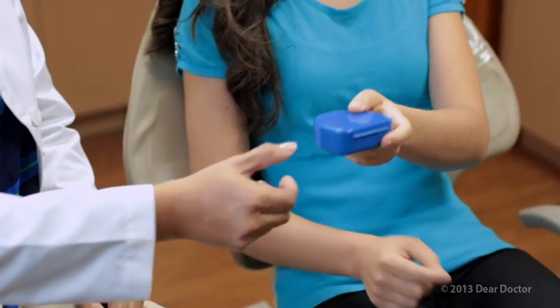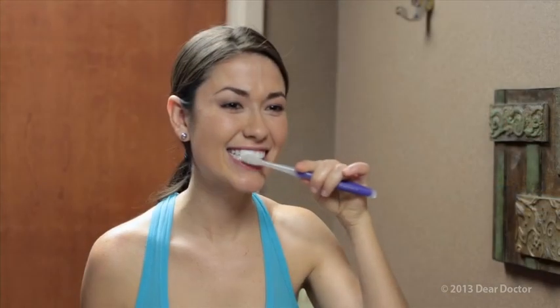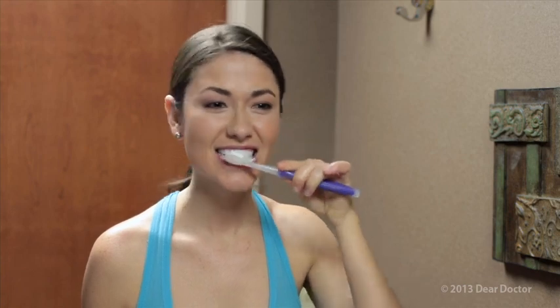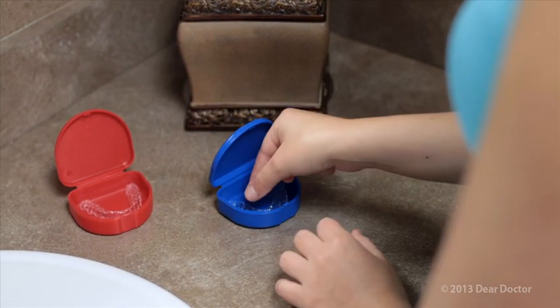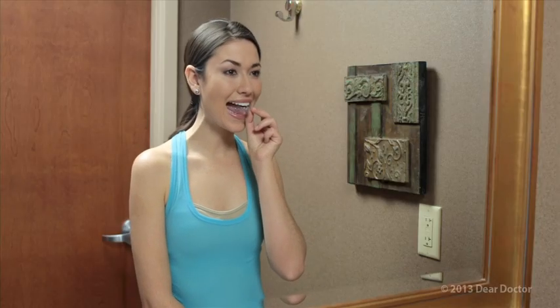Once you receive the trays from your dentist, you will wear the first one for at least 20 hours per day for two weeks, removing them only at meal times and when you brush and floss your teeth. Then it's time to progress to the next tray to accomplish the next gradual movement, and so on until the desired result is obtained. Total treatment time will generally range from 6 to 24 months.